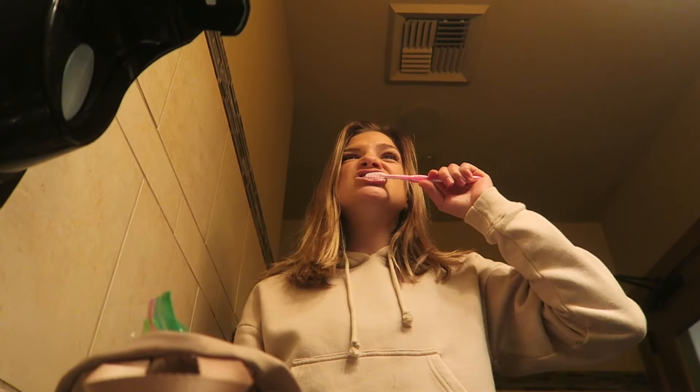Always remove your aligners before eating or drinking, and always brush your teeth before putting them back in. If you fail to do so, the food sitting on your teeth has bacteria that'll grow and creates cavities. If you brush your teeth, you're keeping them healthy and clean.